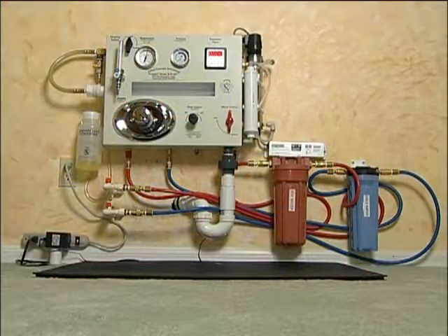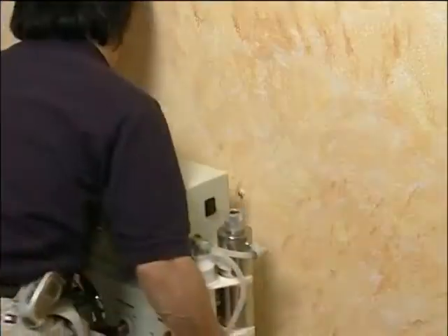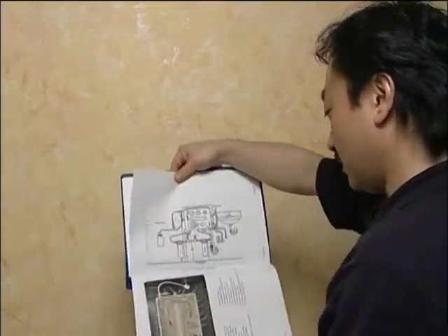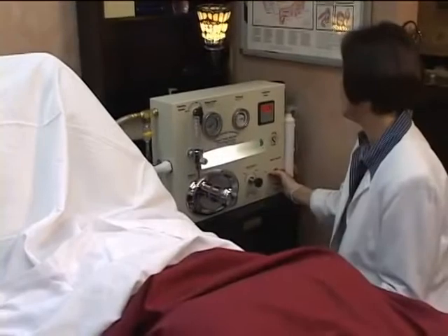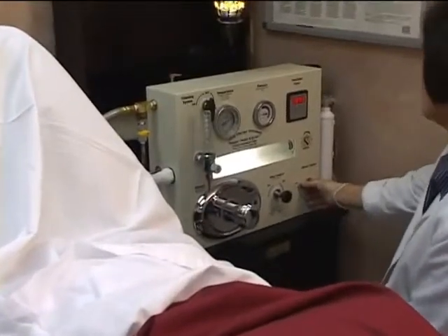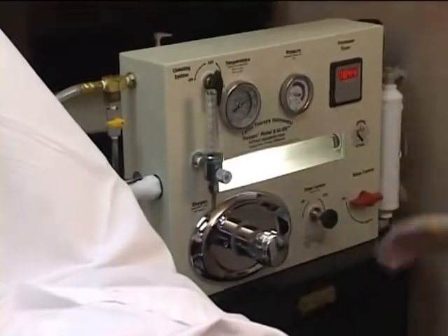The Toxygen instrument is designed for easy installation in a manner that will allow easy disconnect should it be necessary to remove the instrument from the wall. Throughout the installation, please refer to Figure 3 in your manual. This is a schematic designed for optimum installation, although some circumstances may prevent you from installing your instrument exactly as shown. Alternative installations can also be made using a cabinet or countertop, though these are more aesthetically pleasing but present a more difficult installation.